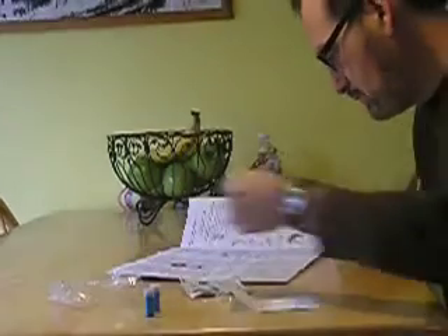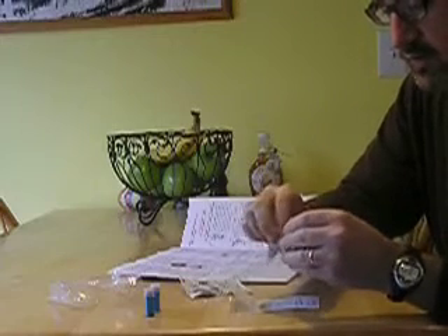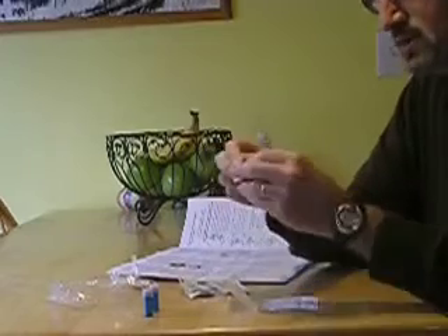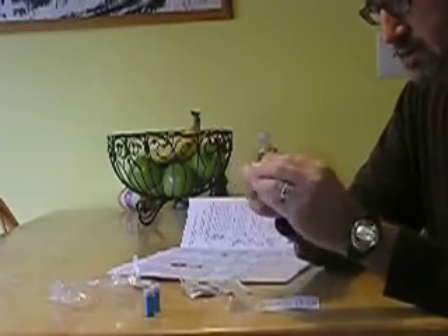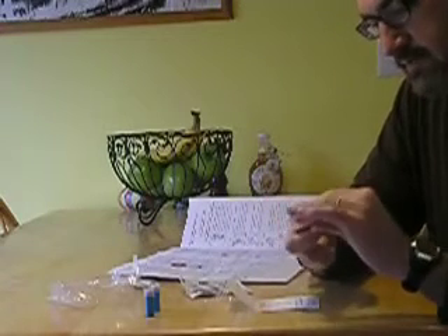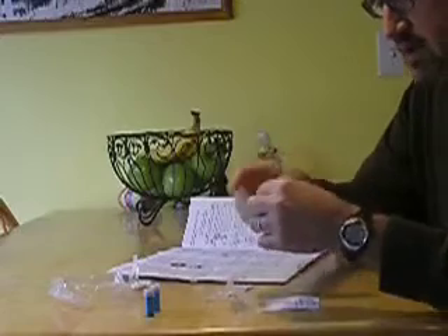Next, I choose my finger and puncture site. I think I'm going to choose my right index finger. Now I'm going to clean it with a little alcohol prep pad — an itty-bitty alcohol prep pad. And then I just dry it with this gauze pad.